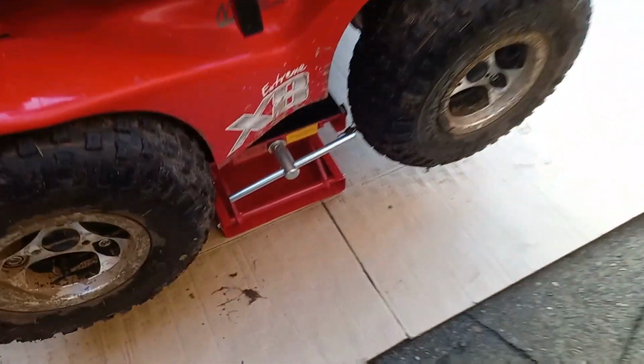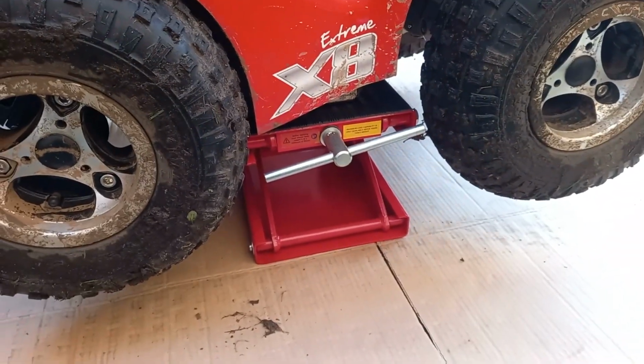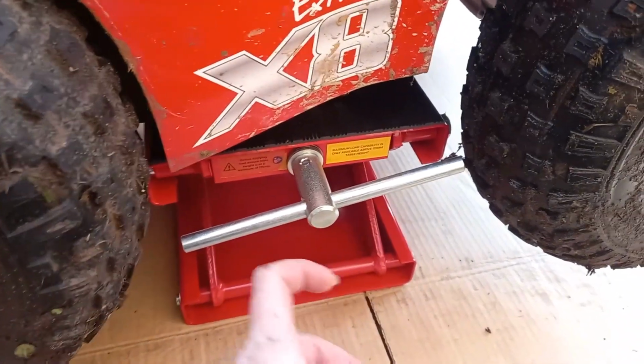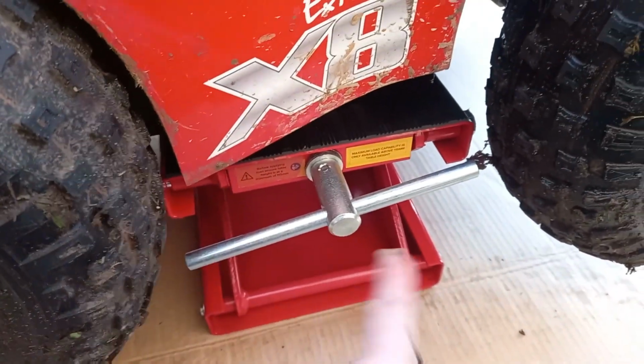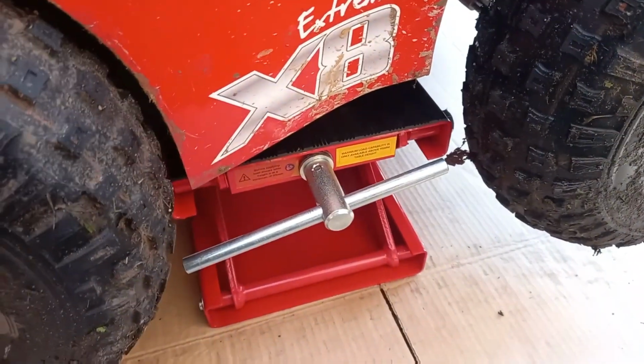We've got the stand in and you can see we've jacked it. It's not the right stand. The stand we actually ordered had got a hexagon on here, so I could have just put the impact gun on and whizzed it up, which would have been better, because I've got to make sure we've got enough room to move this between the two tyres. Quite as far as we wanted.